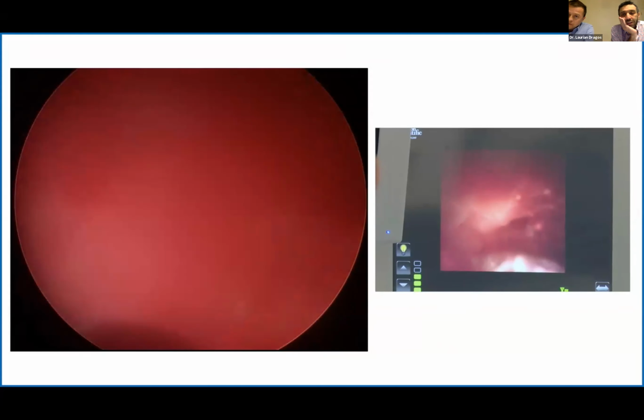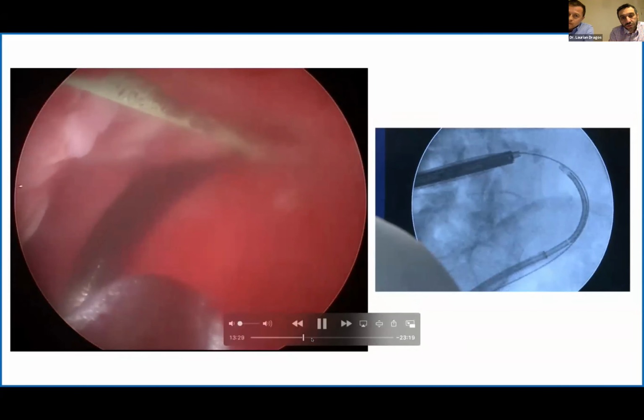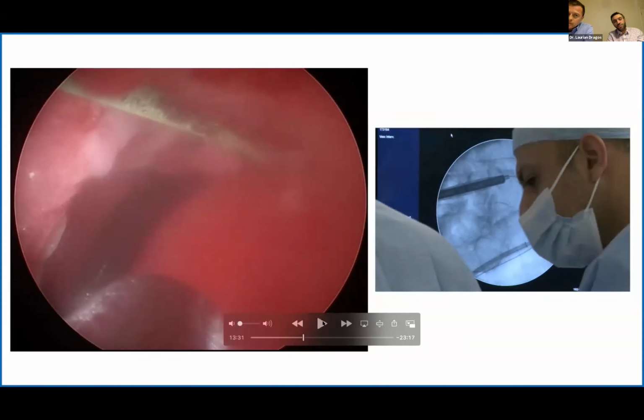So my plan was that I didn't want to end up with a long stone. I'm just going to pause the video here for a second. What I wanted to do was reduce the surface area and make it a flat stone if I could, rather than keep going and make a big hole for myself. However, as you probably appreciated, I was really struggling to begin with to avoid that. So I did have to create enough space for myself to tackle it from underneath in order to make it crumble, so I could access it much better that way. Okay. But if you can get it flat and shave it all off, that would be much easier, rather than ending up with a long tunnel and lots of bigger fragments.